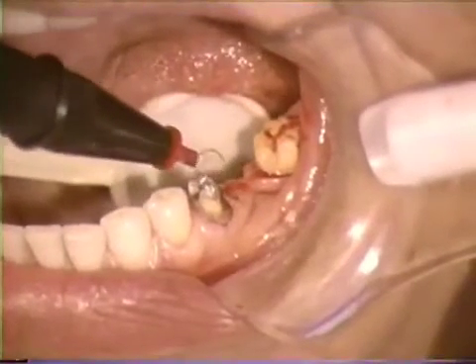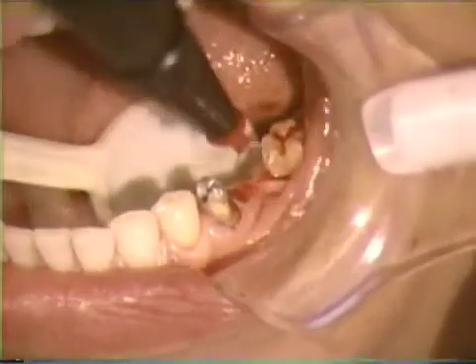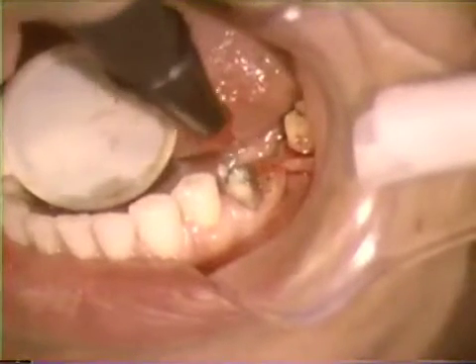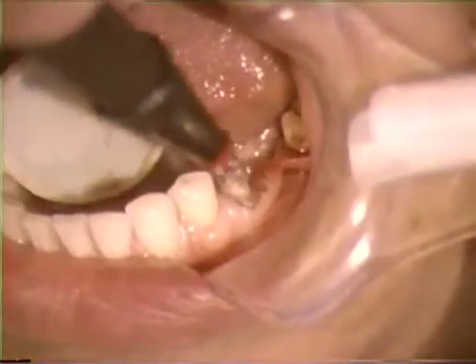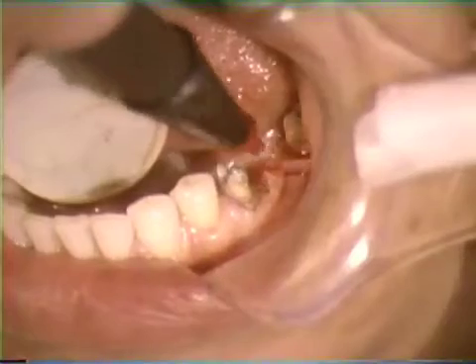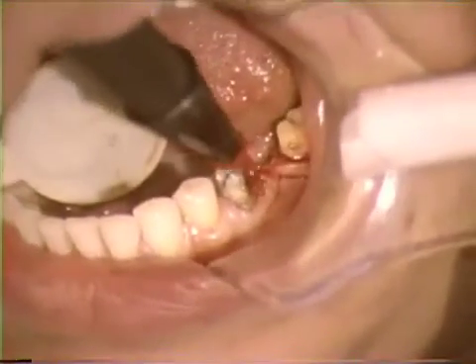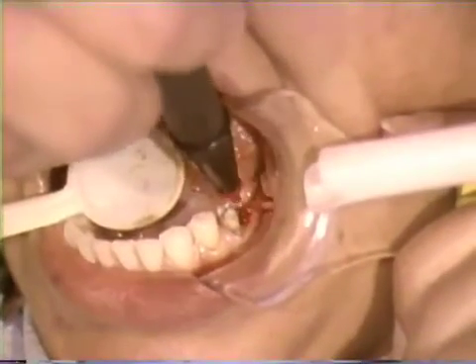Excessive sparking during cutting indicates that the current setting is too high. Additionally, small electrodes are helpful because they require less current than larger electrodes. In general, tissue healing following electrosurgery will be slightly delayed during the first 10 days, but by 30 days the degree of healing will be the same as it would have been following scalpel surgery.